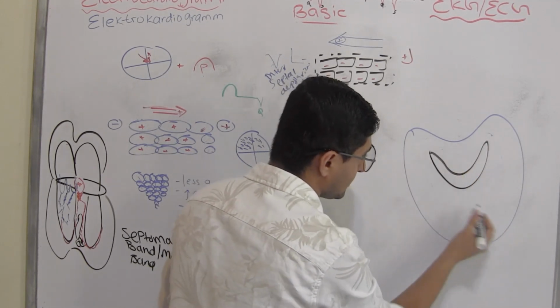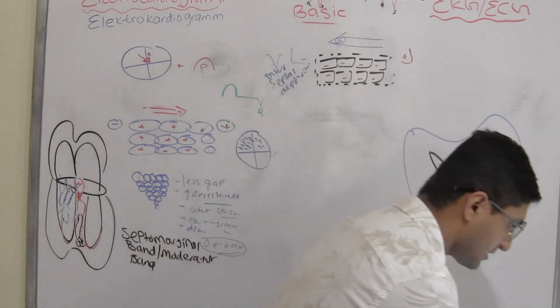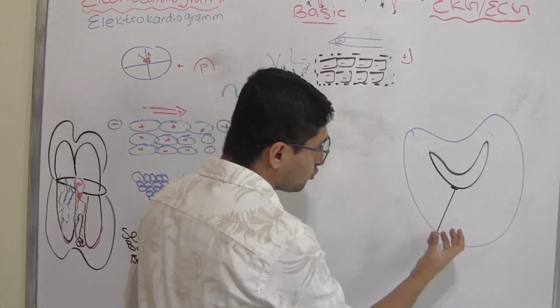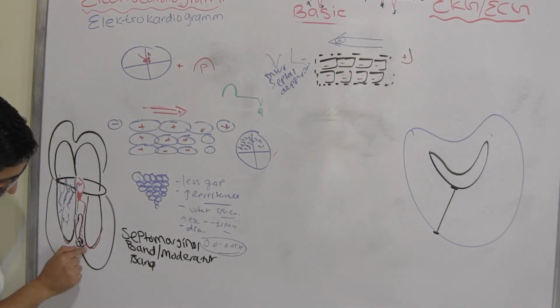And this is all major. Let's say this is all from here to here. Let's say this is my major depolarization. This is a major ventricular depolarization happening, right? In most parts of the ventricles, left ventricles, right ventricles, right? See, whenever the ventricle depolarizes, remember, the lower end is supplying here, right?